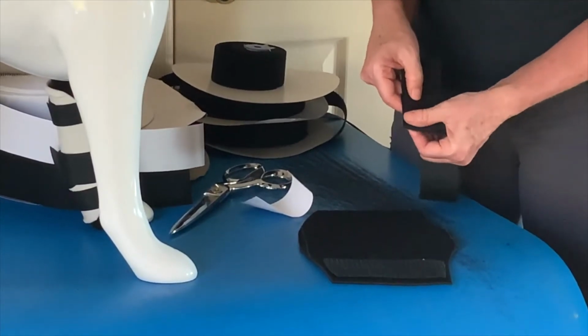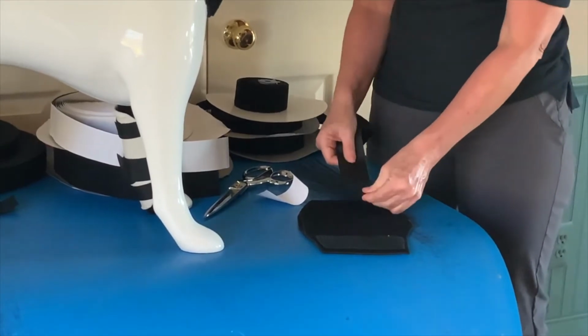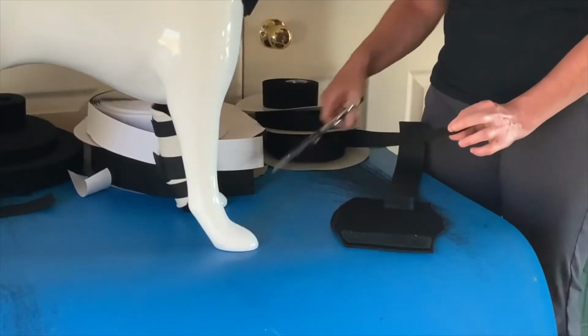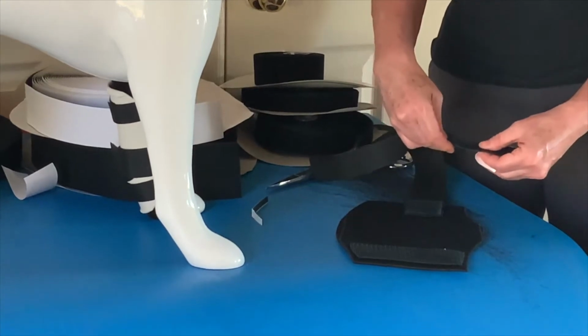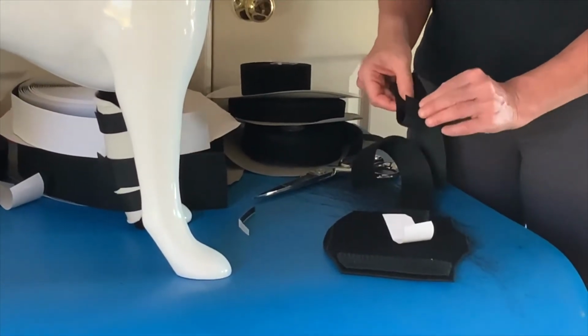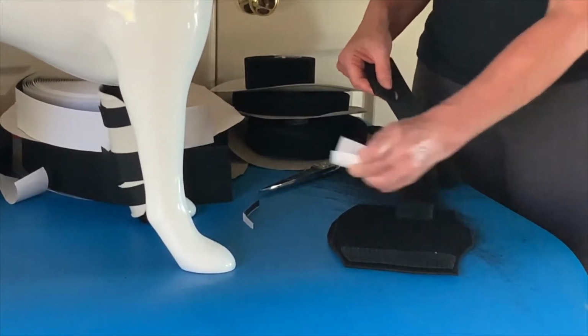Cut a piece of self-adhesive hook, then fold it over the end of a nylon strap. Next I'm using a 1.5-inch wide strap as my most proximal strap. Again, just take a piece of self-adhesive hook that's 1.5 inches wide and affix it to the end of a 1.5-inch wide nylon strap.